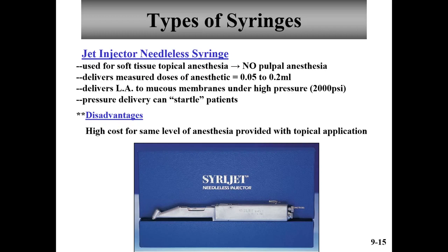But again, the hissing sound, the pressure is startling, and it really is not much in vogue. I don't know anyone that's ever used them routinely, but be aware that it is out there, and it is an option for you.